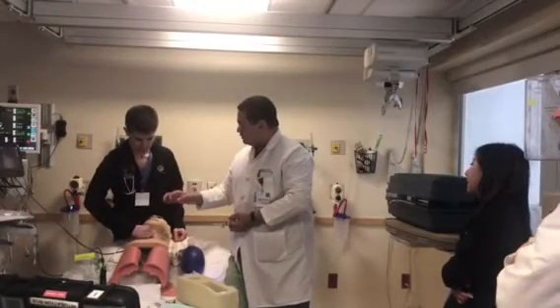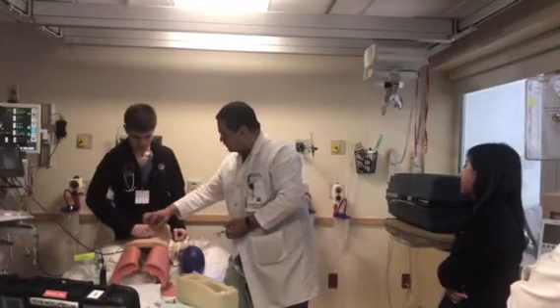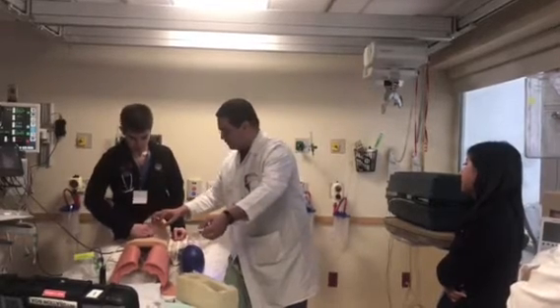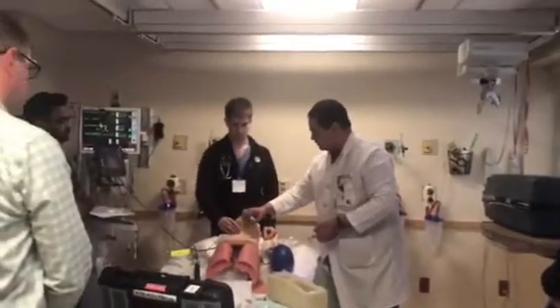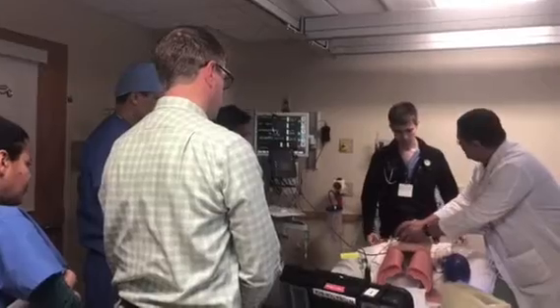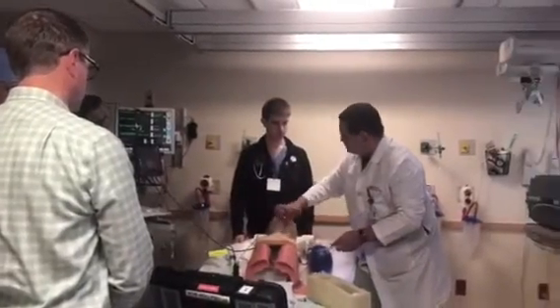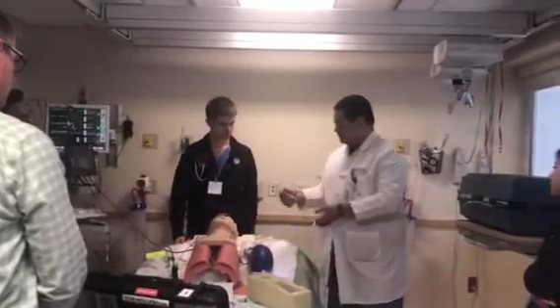Number 2, you're holding the larynx so it doesn't move away from you. Number 3, if you're gonna make a cut, which we're gonna talk about in a second, in an open cric, you are limiting yourself to from here to here. Because if you go overzealous and go here and here, you can cut the venous plexuses and cause a lot of bleeding, right?